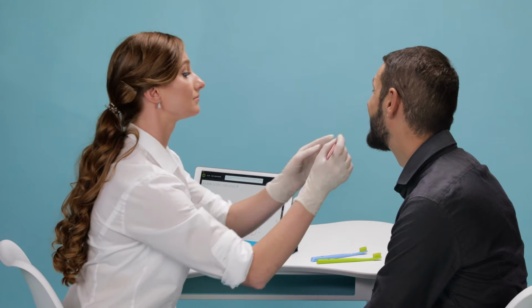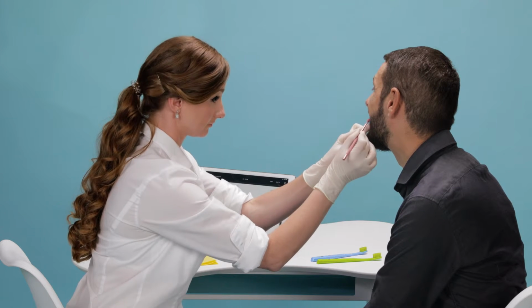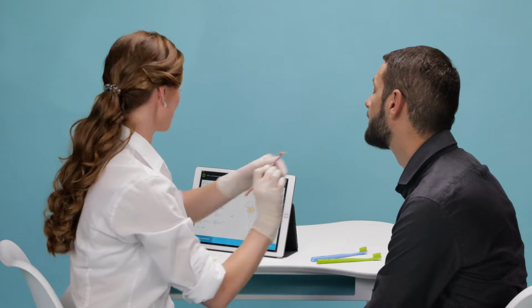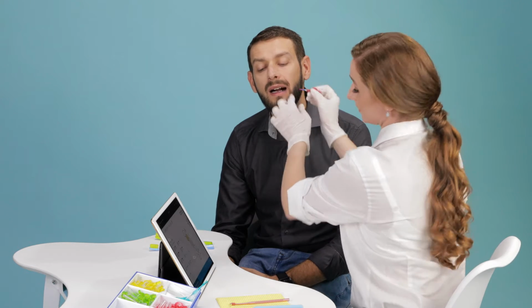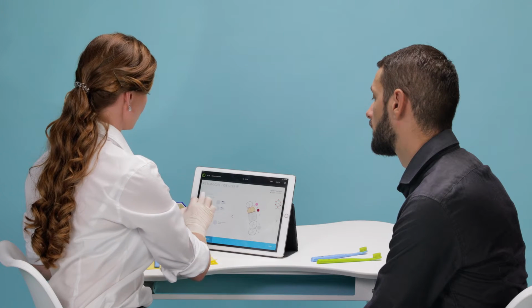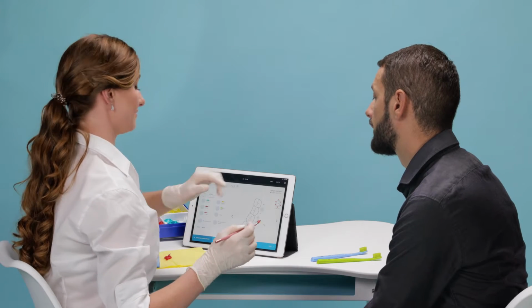As I continue to the upper left sextant, I notice that an interdental space is too large for the colours indicated on this IAP. So I change to the perio IAP to measure the interdental space. On to the lower left, I am back to using the prime IAP.